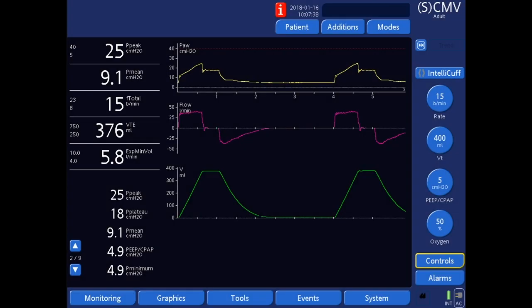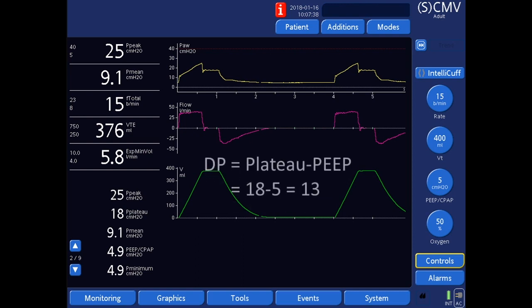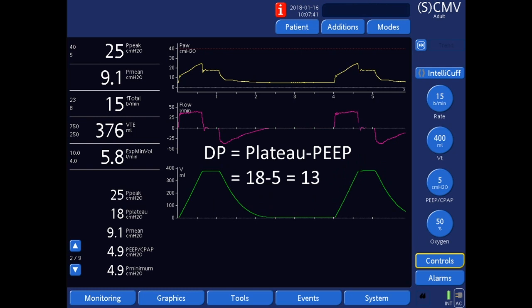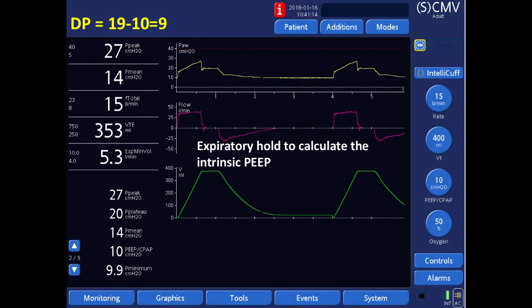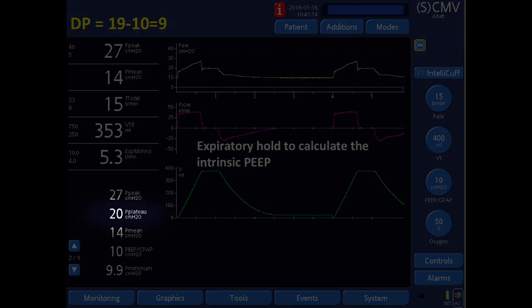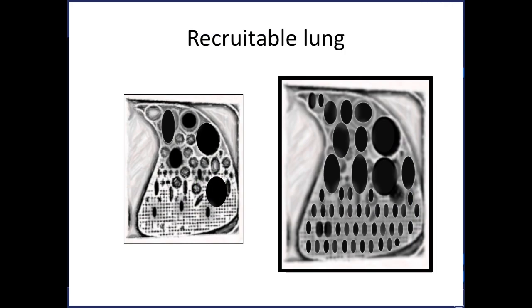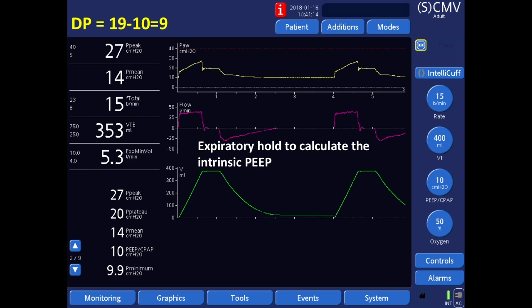Let's look at a ventilator waveform and calculate the driving pressures. Driving pressure is plateau minus PEEP: 18 minus 5 equals 13. Now let's increase the PEEP from 5 to 10 and see what happens. The driving pressure becomes 19 minus 10, which is 9. We see that the driving pressure was lowered without increasing the plateau pressure or the distending pressure. A decrease in driving pressure after an increase in PEEP reflects recruitment. On the other hand, if increasing PEEP results in a larger increase in driving pressure, this suggests a non-recruitable lung and that we may be violating the upper inflection point on the PV curve, in which case a decrease in tidal volume may be necessary.